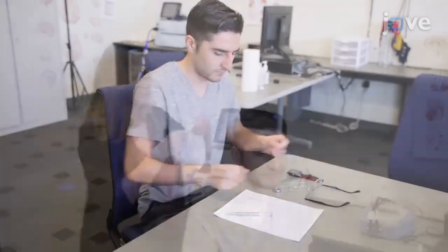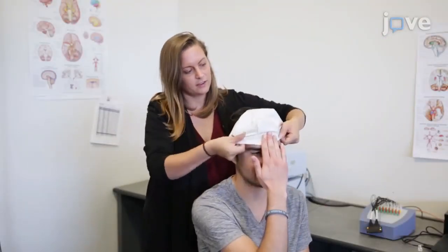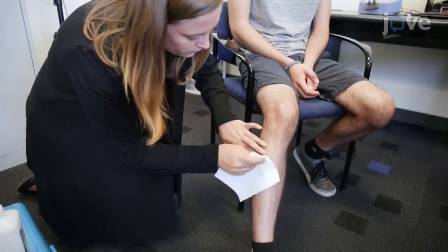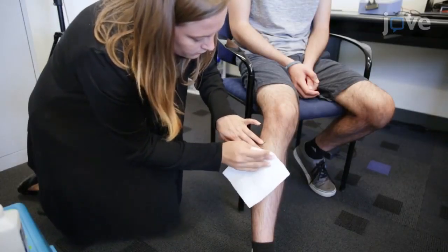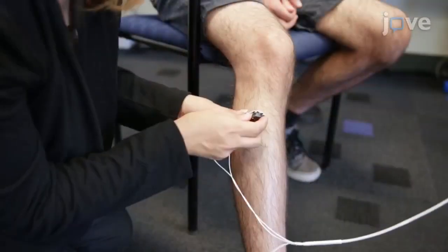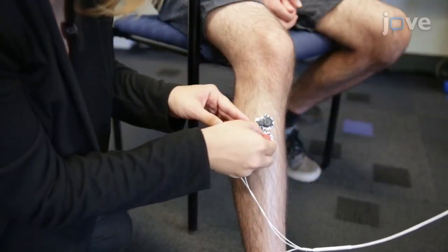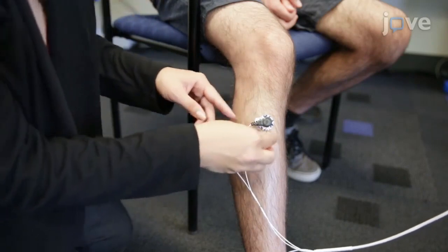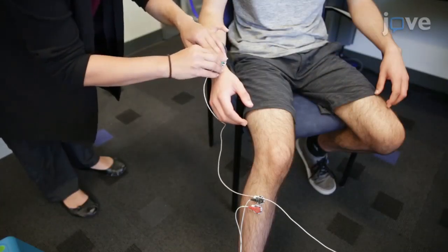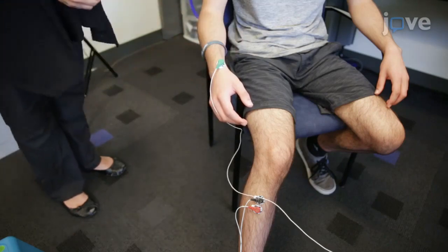Next, fit a grid-marked swim cap to the participant's head. Clean the skin over the tibialis anterior muscle thoroughly, then attach two differential EMG recording electrodes to this area. Attach a third ground electrode to the skin over a bone somewhere else on the hand or arm.